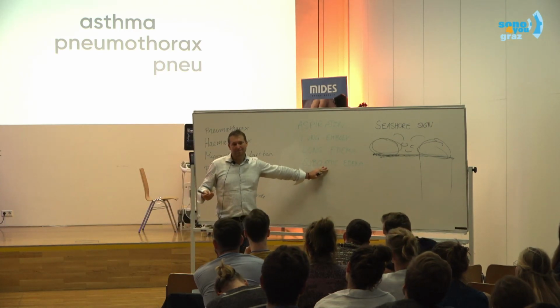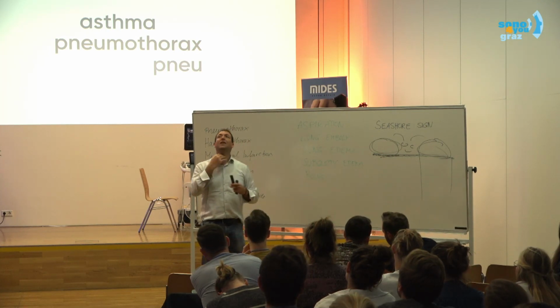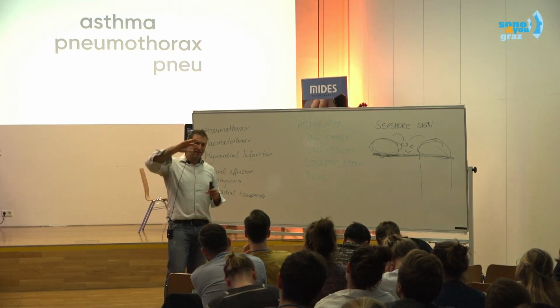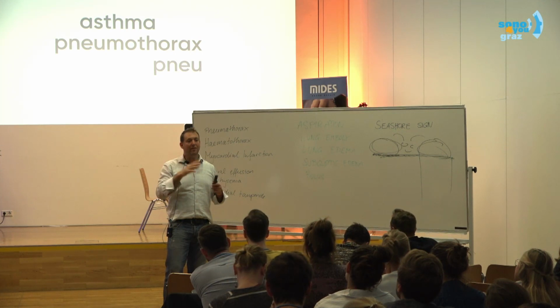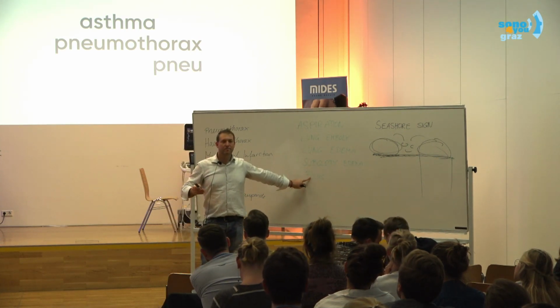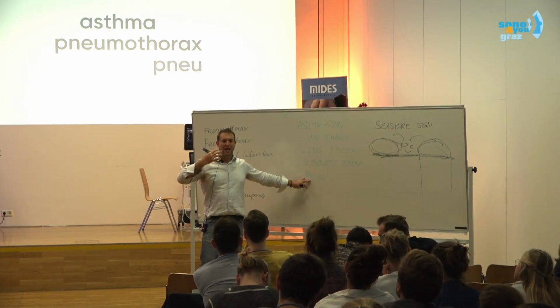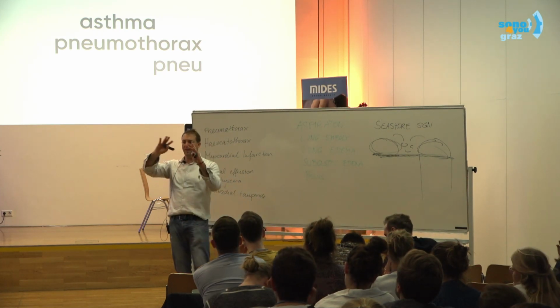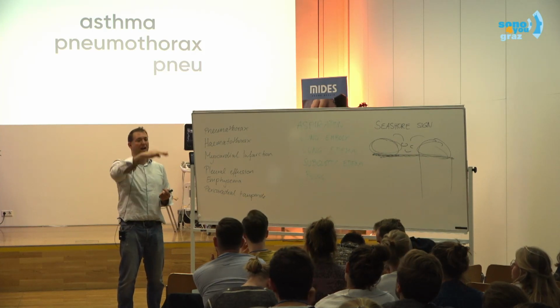Subglottic edema, you cannot see. Why? Because even if we looked up in the trachea, once there is air inside the trachea, you cannot see. So whatever is hidden, no. And a bolus, if it's supraglottic, you cannot see. If it's subglottic, again, if it's somewhere inside, it will be lost in the air of the trachea. It will be just A lines, so you cannot see.